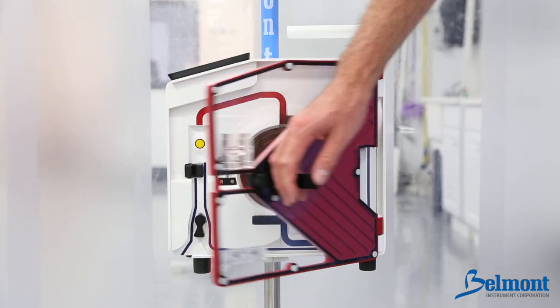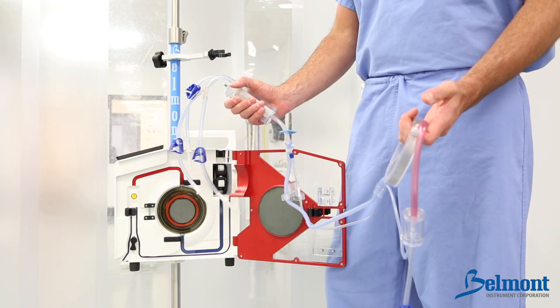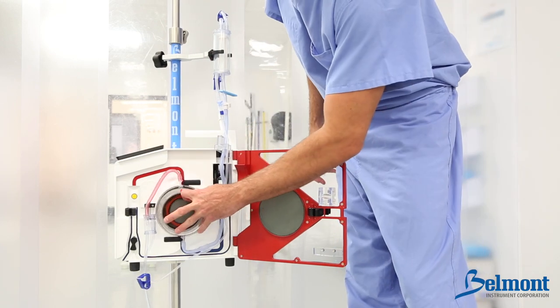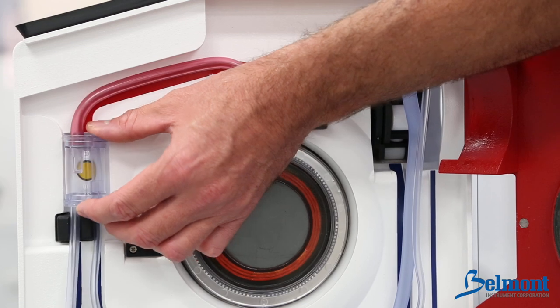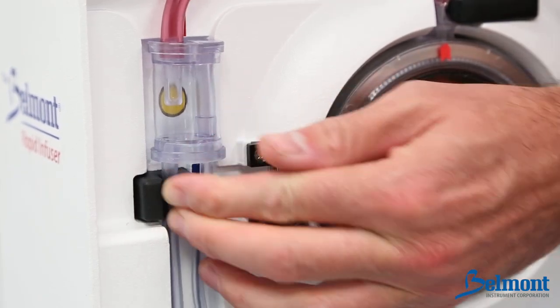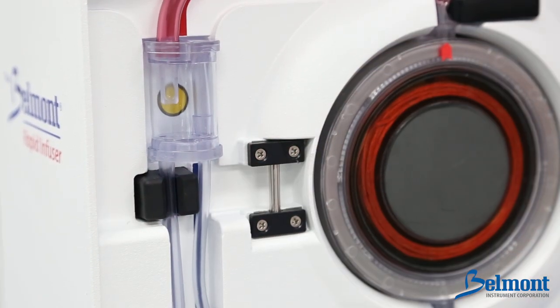Open the door of the unit. Holding the heat exchanger in your left hand and reservoir chamber in your right, snap the reservoir chamber into the holder. Insert the heat exchanger with the red arrow pointing up. Align the red tubing on top of the red stripe and place the pressure chamber into the pressure channel.